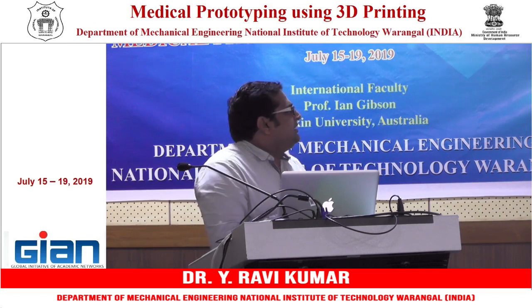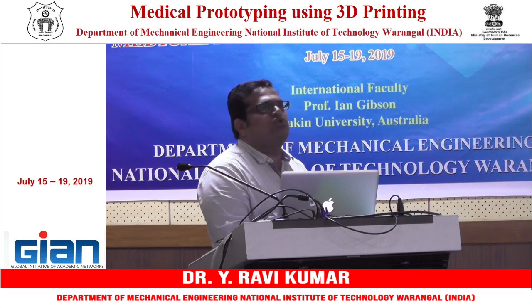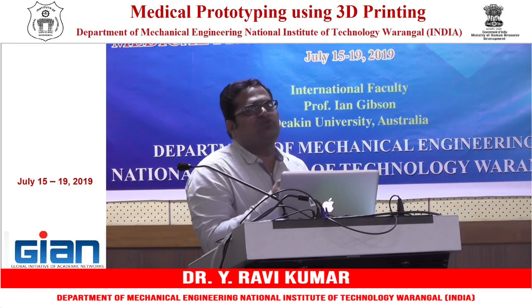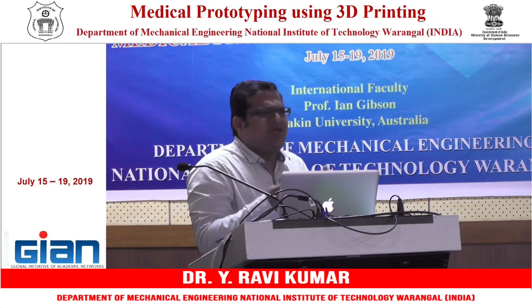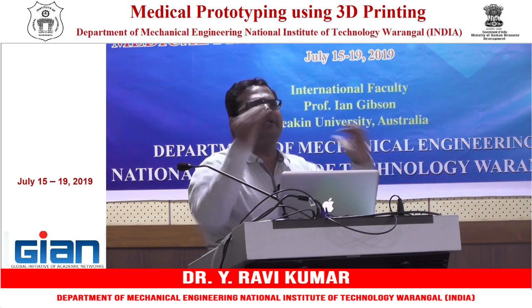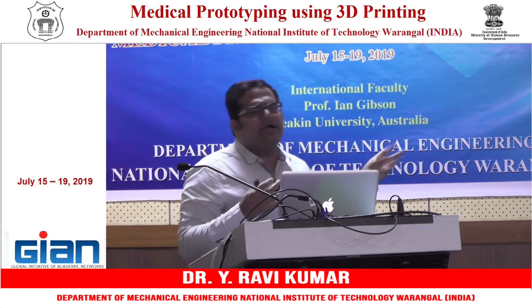Definitely that will be the first level of application, where you want to visualize in 3 dimensions rather than the 2-dimensional images which you normally get out of a CT or MRI, which are also black and white images. You want to enhance or supplement those images and reconstruct a 3D model in different colors, with some rendered image.